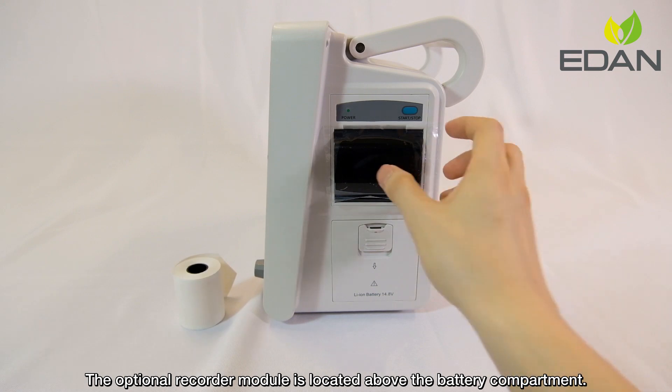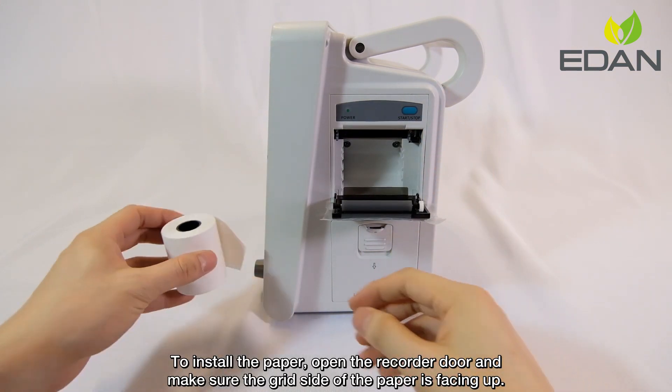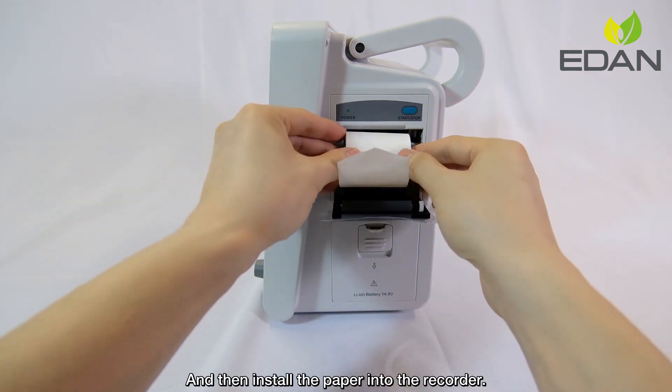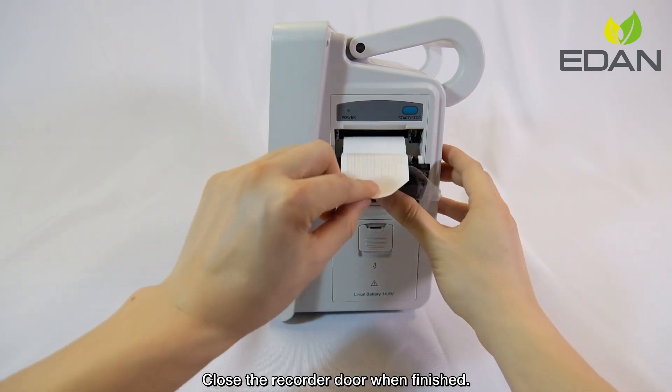The optional recorder module is located above the battery compartment. To install the paper, open the recorder door and make sure the grid side of the paper is facing up. Then install the paper into the recorder and close the recorder door when finished.